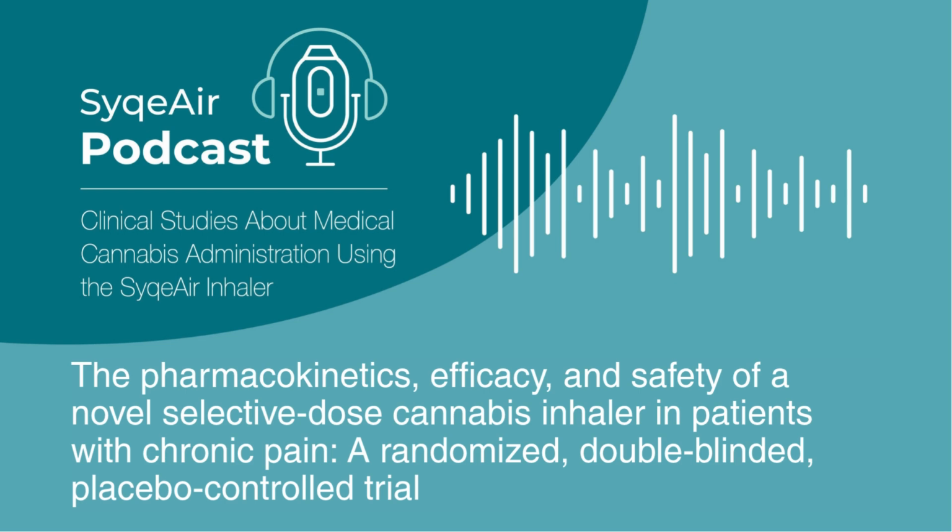Interesting. And what makes it different? What are the key features they highlight? Well, first, it's non-combustion, which is important. But the really crucial part seems to be the automatic thermal and flow controllers. Okay, what do those do? They're designed to ensure that the delivery of the cannabinoid aerosol to the lungs is basically independent of how the patient inhales. So whether you take a slow breath or a fast breath, the aim is consistent delivery. That is a big deal. Patient inhalation patterns are a huge source of variability, usually.